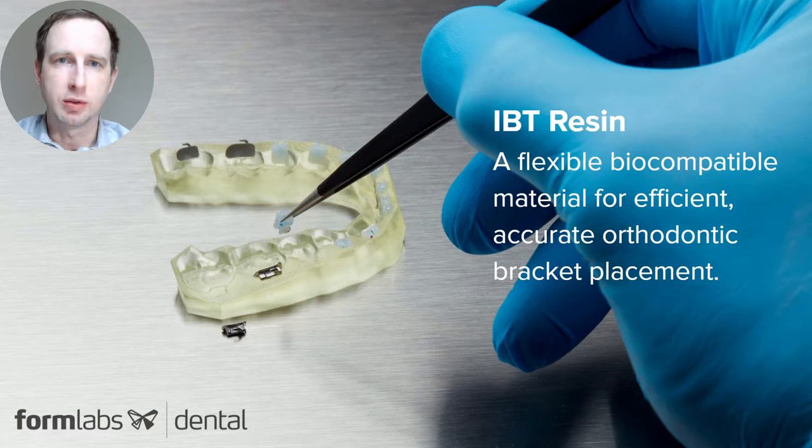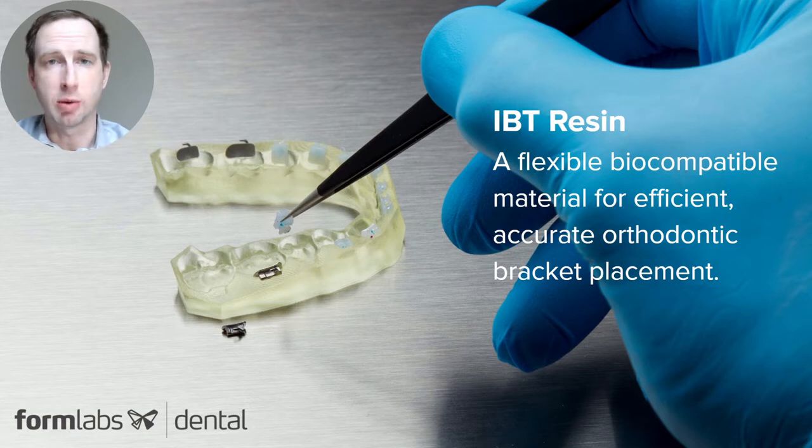The advantage over traditional single bracket placement is you're able to put in these appliances and place the brackets all at one time. This will greatly increase the efficiency and reduce chair time with patients. During the development of this product, we made sure that the material met the industry needs with how it gripped and held the brackets in the pockets, but also worked with external beta testers and orthodontists in the market to make sure it met their expectations as well.